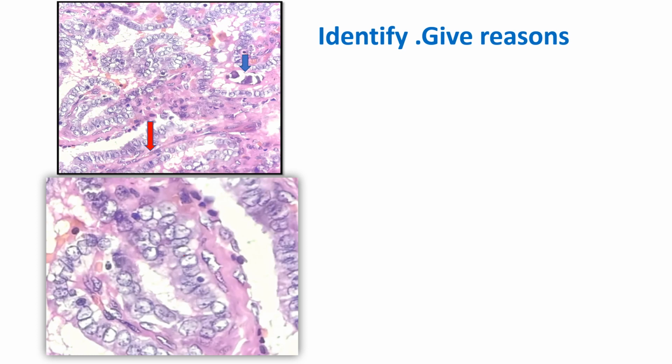of thyroid. Other features of papillary carcinoma of thyroid are, see this at the tip of the arrow, the nucleus which is enlarged shows an intranuclear groove. So intranuclear groove is seen, and this cell shows a hole in the nucleus.